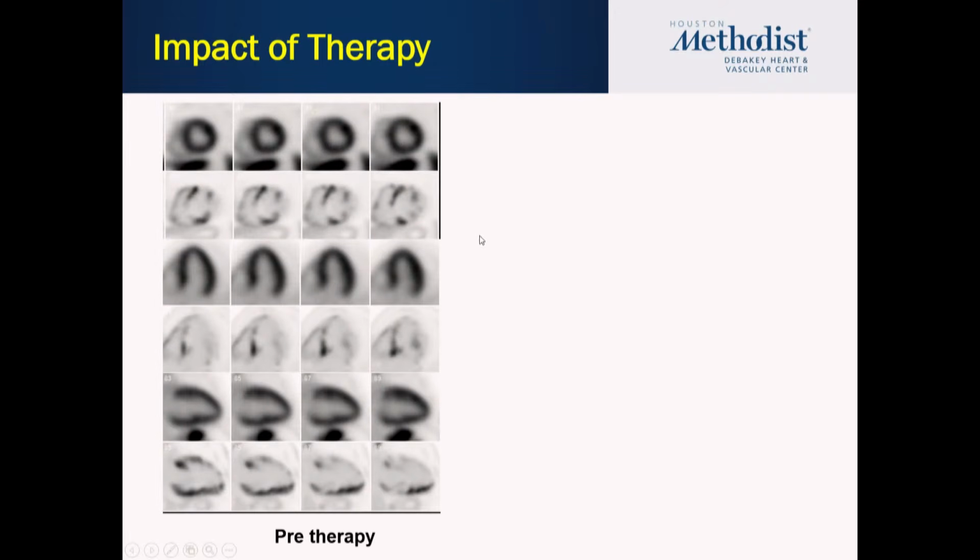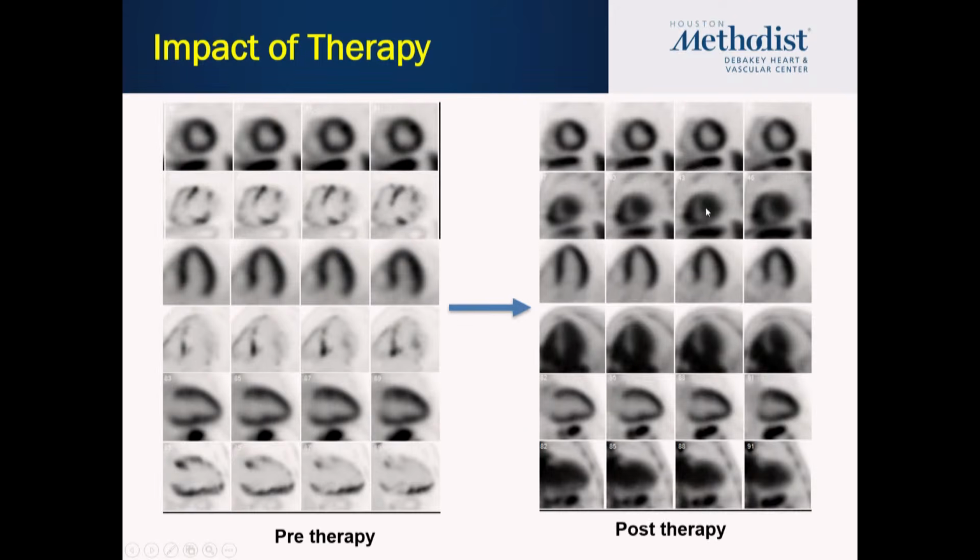I think the biggest advantage of PET is that once you establish the diagnosis by MRI and you see if there is disease activity, you want to follow these patients and see if there is improvement after therapy. And this is where it's an important unmet need with other imaging modalities. You can see here this is a patient who has significant FDG uptake, then 3 months of steroid therapy. Now it's all gone, and it's all now in the blood pool.